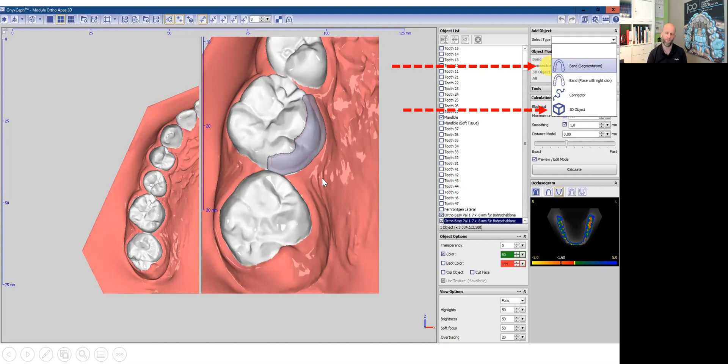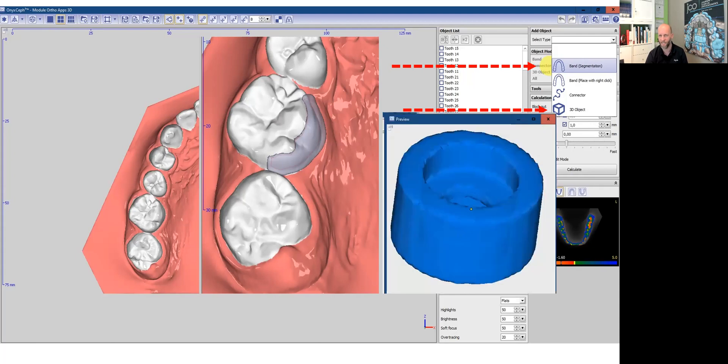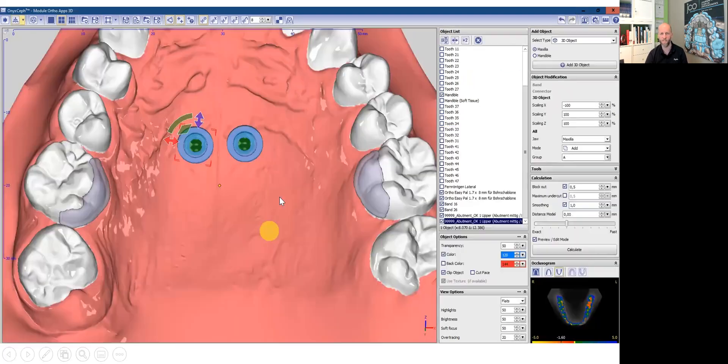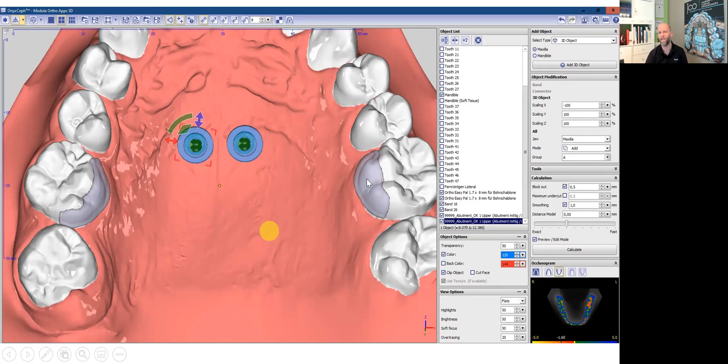After we have placed the band, the molar pad, I click on 3D objects. And what we need as a 3D object is now an abutment because we have the TADs already in the bone. And on top of the TAD, we need an abutment. So we select out of the 3D object list an abutment. This is automatically transferred to the corresponding TADs. So now we have the TADs, the abutments and the palatal molar pads.